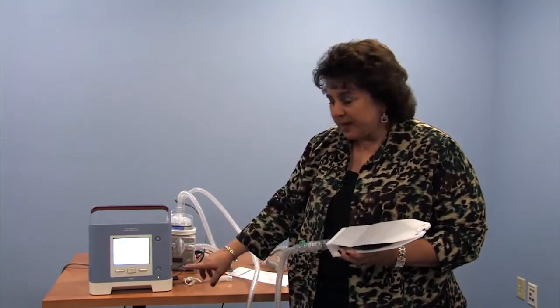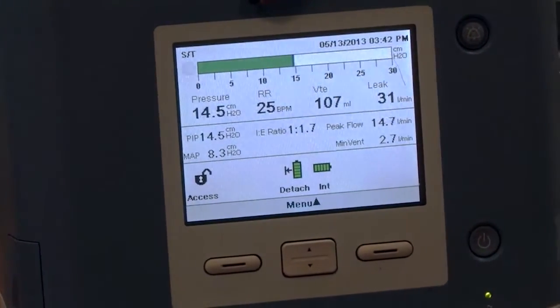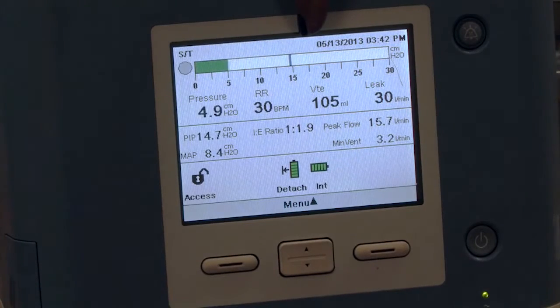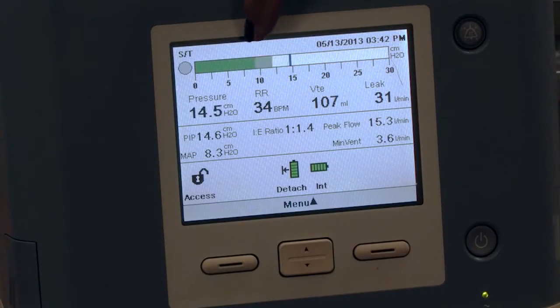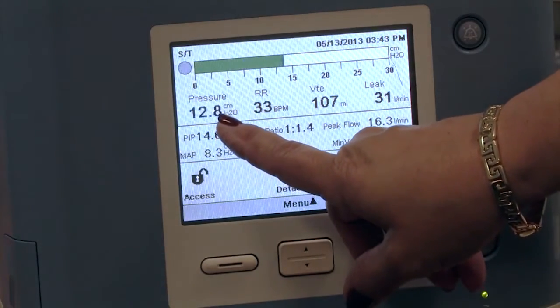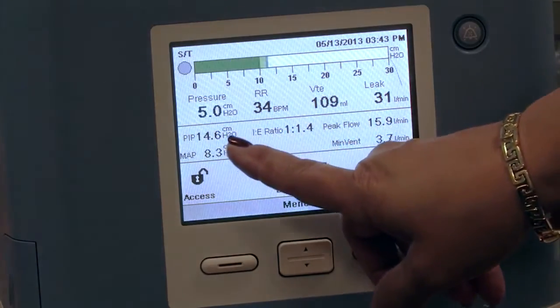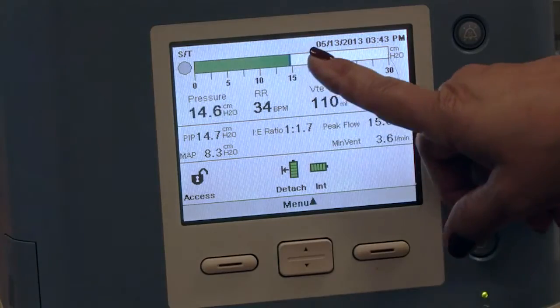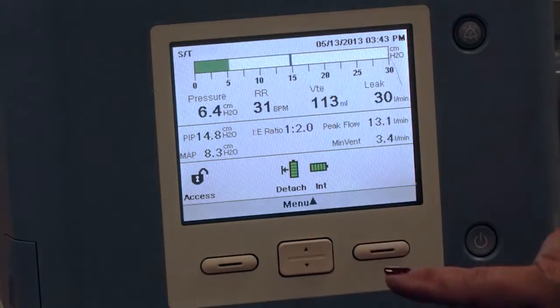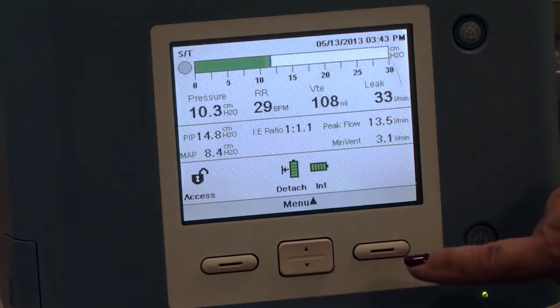What we see here on our patient now is, and from what you learned before, you should be able to tell me, this patient's breath goes up to 15 and down to 5. You see it here in the bar. You also see it here, pressure, up to 14.6, down to 5. So you should be able to tell me that this patient's on pressure support or pressure ventilation or BiPAP based on this mode, and their numbers are up to 15 and down to 5. But let's look in the settings and see for ourselves.